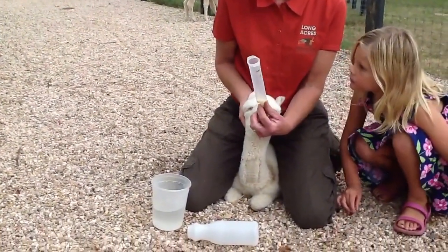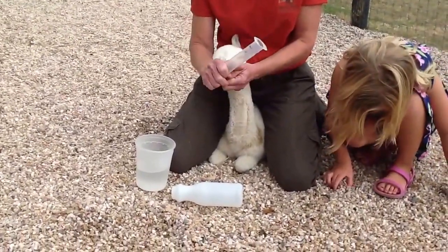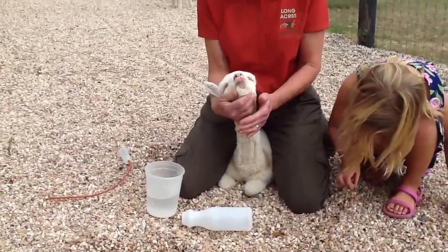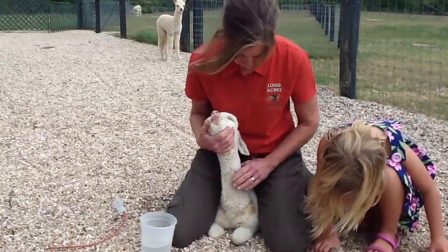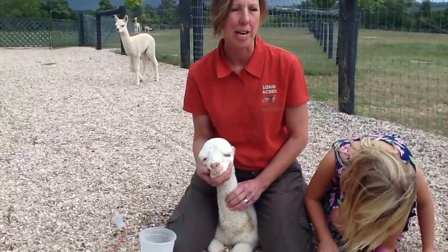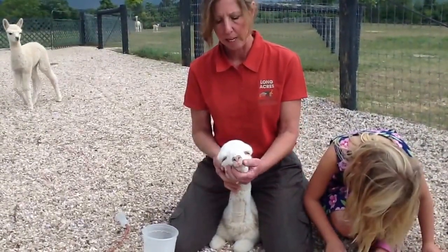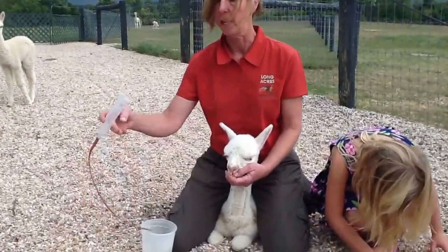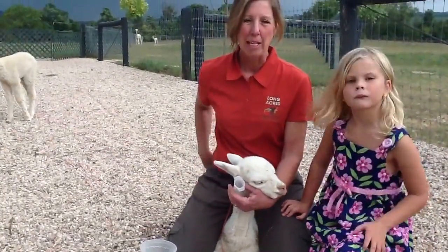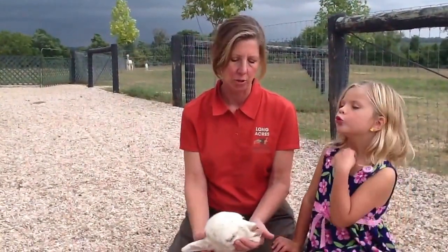But if you put milk down into the lungs, that would really cause a lot of problems. Now the milk is the whole way down — I'm going to pinch the tube off and pull it out quickly. That's it. There are several different ways that you can double check for position. As the tube's going down, you can actually feel along the left side, which is where the esophagus is, and you can actually feel the tube going down. That would be one way. Another way is to inject some air — once it's in place, use your plunger and inject some air and listen back in the stomach area to see if you hear the air going in. That's a little tricky to do.